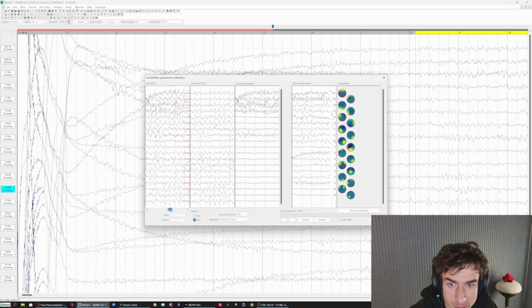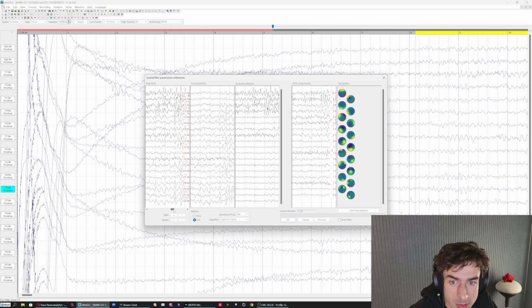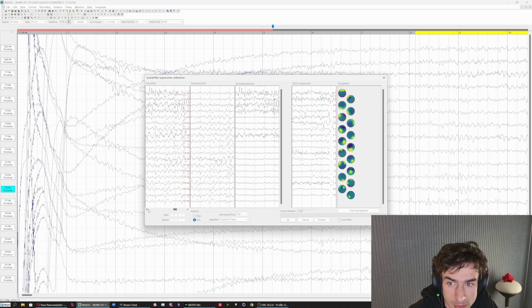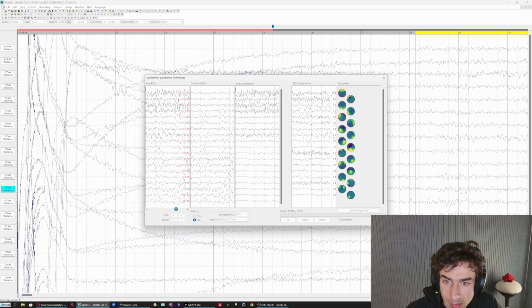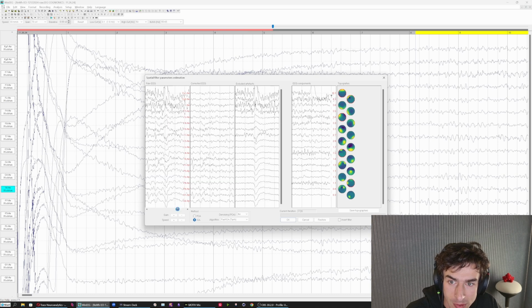With that one, we want to be extra careful since it is so highly spatially constrained, that we're also not removing the alpha band activity. And it looks like this has done a fantastic job, because here we have an abundance of that alpha band activity, and it really hasn't been squashed in a meaningful way, although it is being slightly reduced, right? But to an extent that it is workable. And that might be most of what we wanted to get out as far as artifact is concerned.